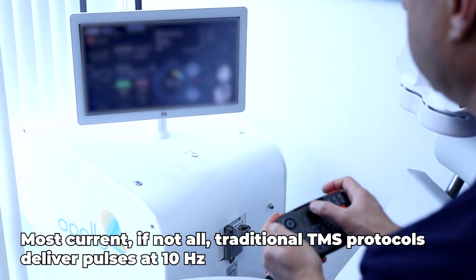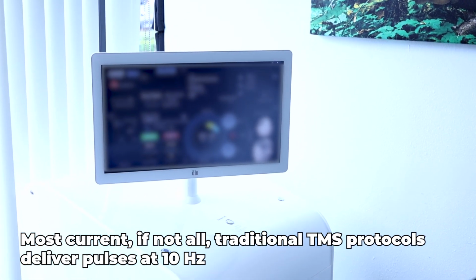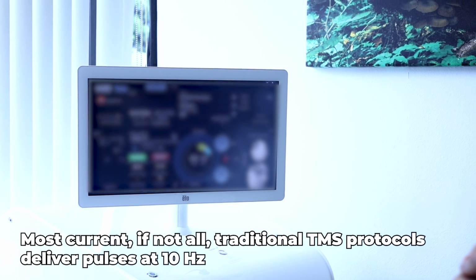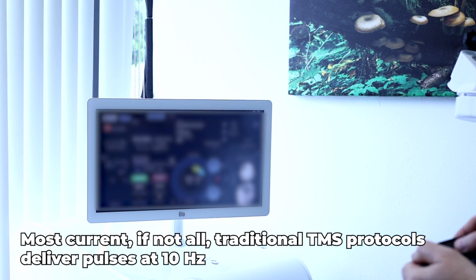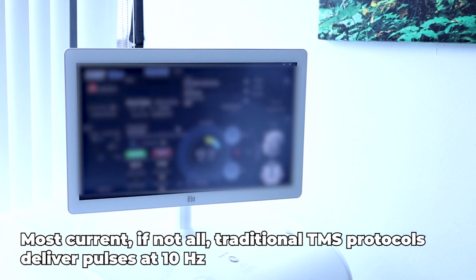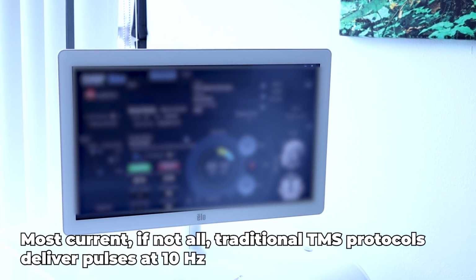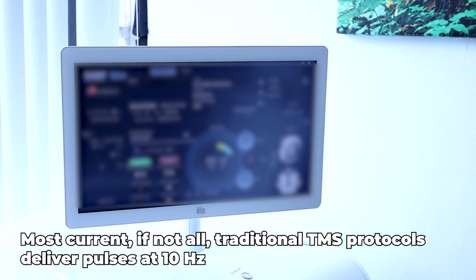You see how it says 10 hertz right here? So this is the regular TMS. It only delivers the treatment at a frequency of 10 hertz. Okay. Why is this dramatically different? Because this protocol, the brain tuning protocol, is going to deliver the treatment based on his EEG. It's not going to be 10. It's going to be whatever the EEG says. It could be 9.5, it could be 10.3, but it's going to be individualized to his brain activity. And that is the marvelous thing about it.